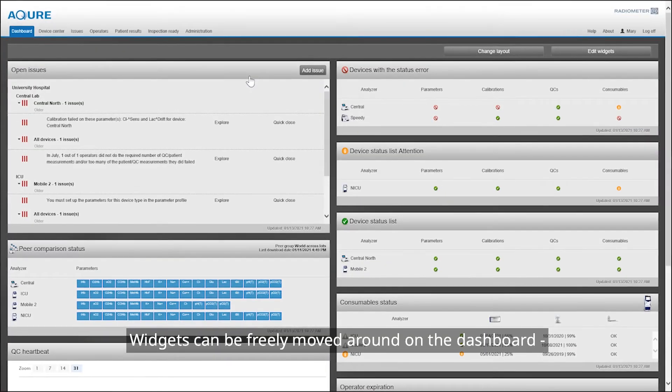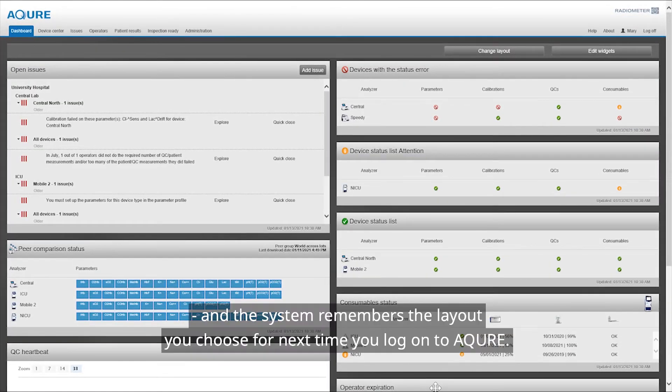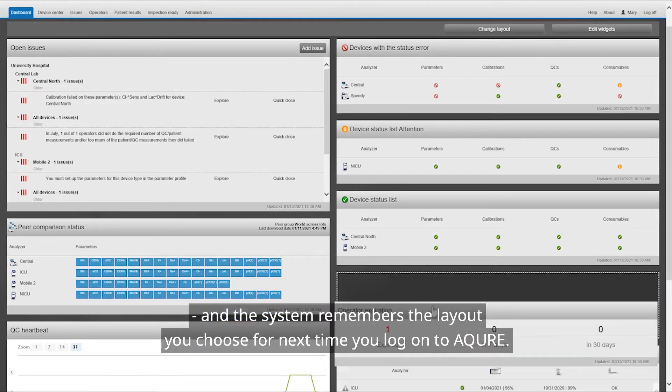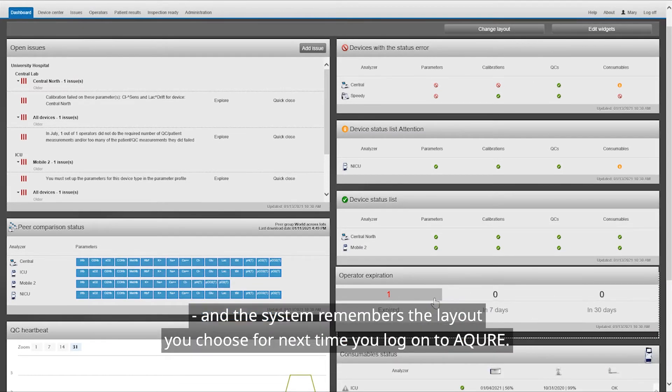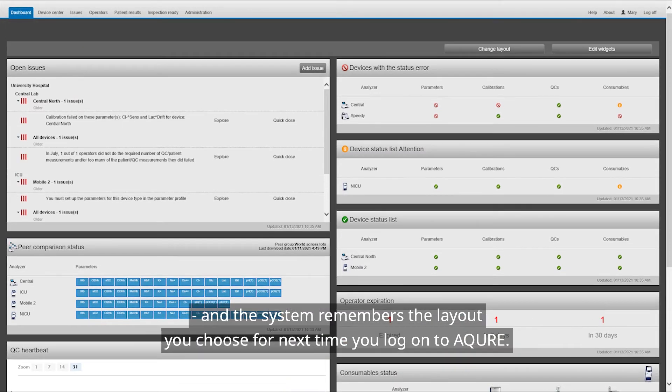Widgets can be freely moved around on the dashboard, and the system remembers the layout you choose for the next time you log on to AQURE.